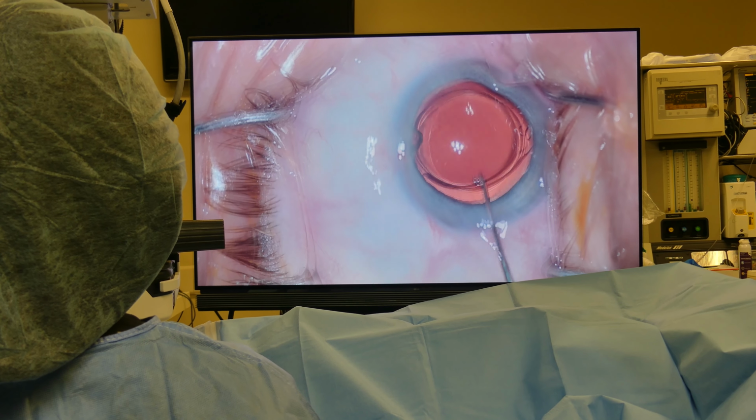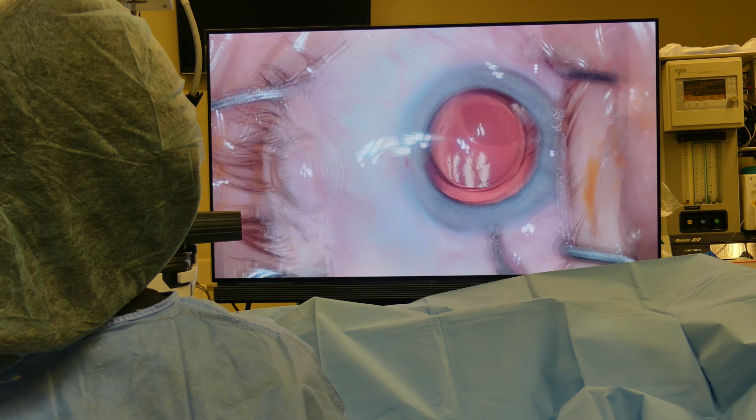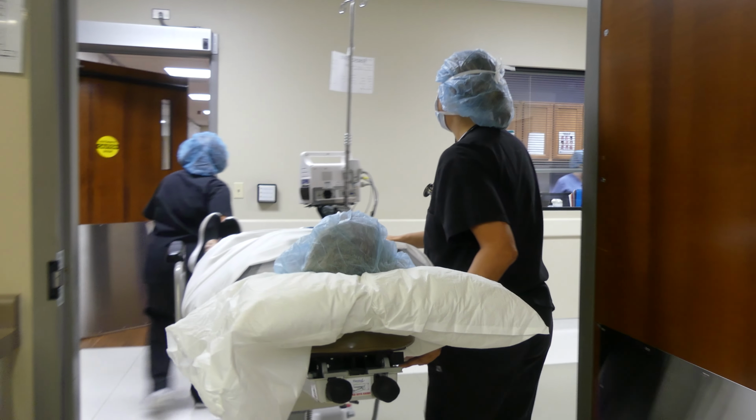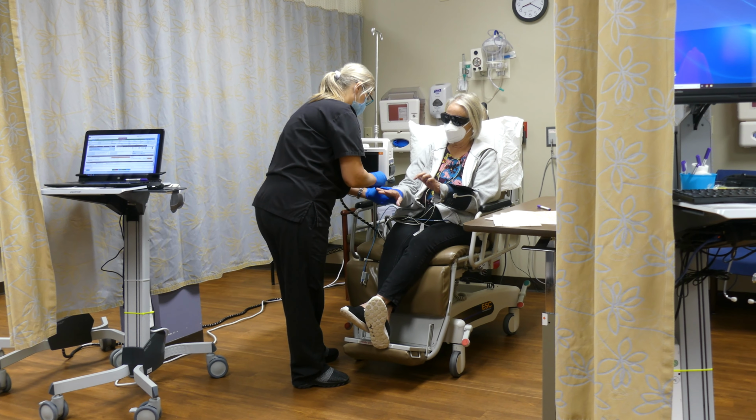During surgery, you'll see a nice light show as I ask you to look toward a bright light. You'll feel some cold water washing your eye from time to time, but it shouldn't be painful. After a short recovery, you'll go home and rest. Most people have minimal pain after surgery.